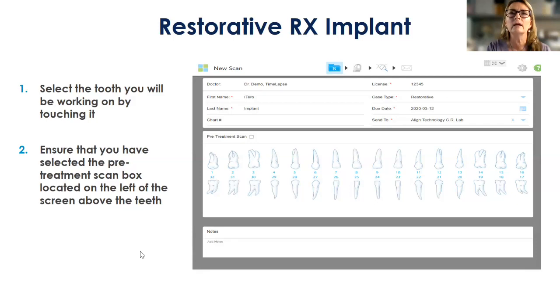Astra EV. Dr. Ramos, I am not familiar with Astra EV specifically. That EV is hard to seat, so I'm going to leave that open in our chat and come back to it. And I will do some investigation and see if there's any helpful tips from AstraTech as to what could be done to make that an easier process for you.